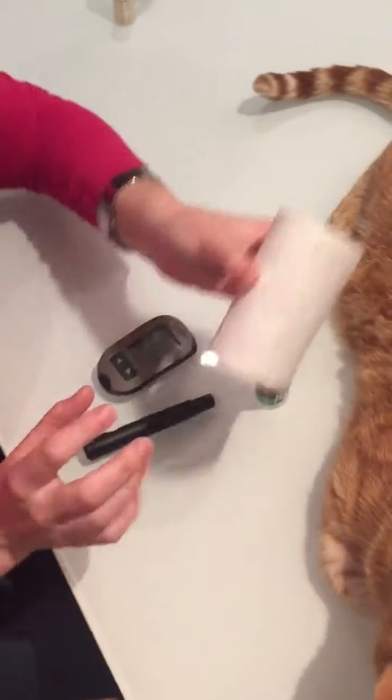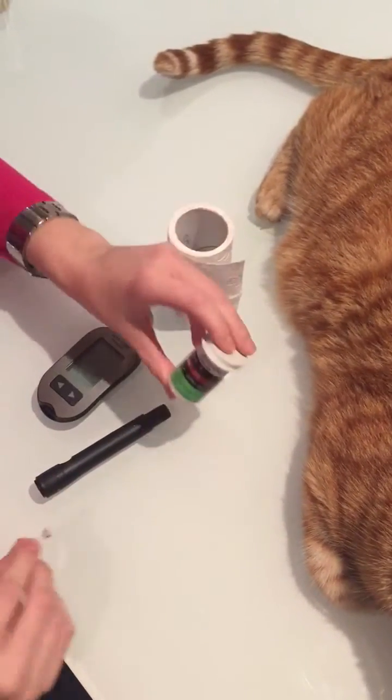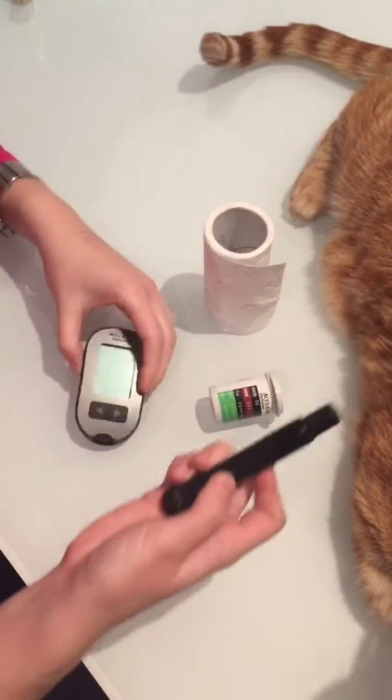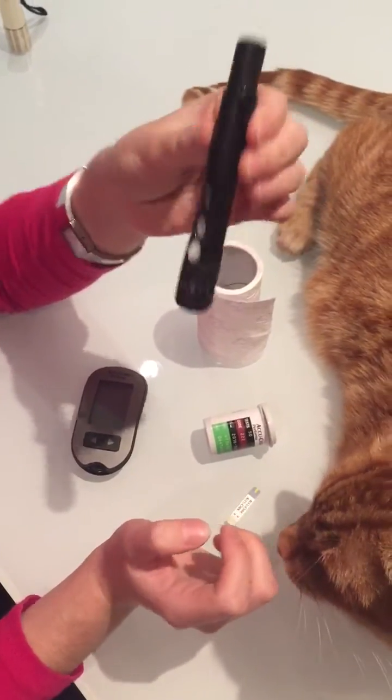So things you'll need are some toilet paper or a tissue, your test strips which look like this, your blood glucose meter, and a lancet pen or a lancing device of some description.